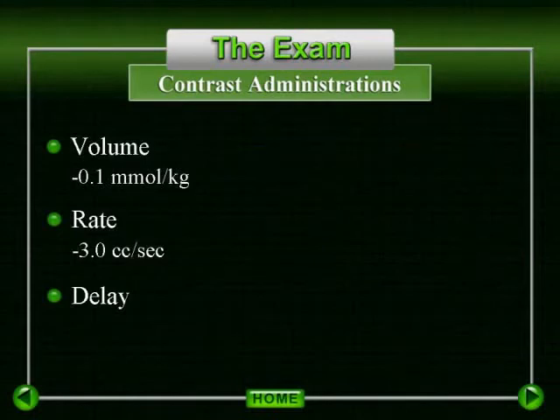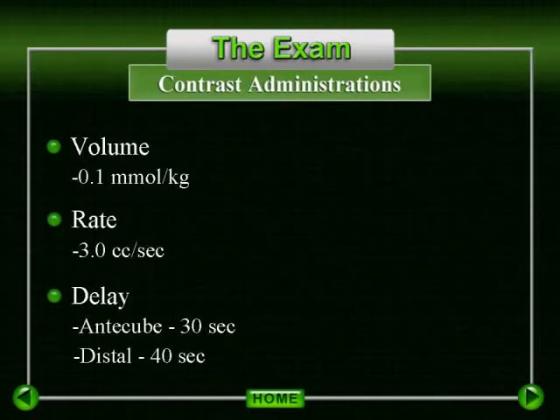The initial post-contrast MRI acquisition should begin 30 seconds following initiation of the contrast bolus when administered in an antecubital site, and 40 seconds following the initiation of contrast administration if it is administered more distally in the hand. This too should be meticulously adhered to.